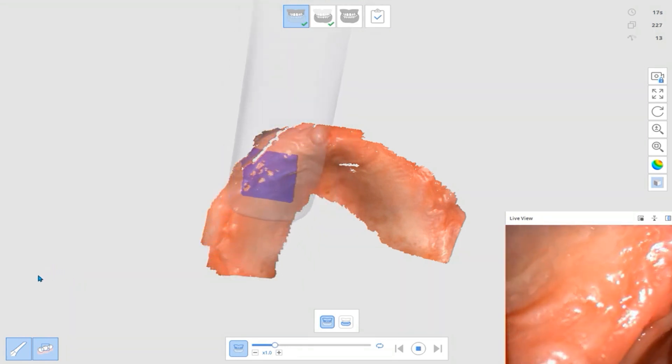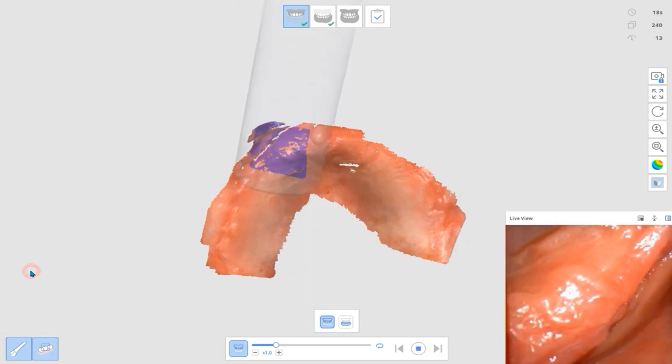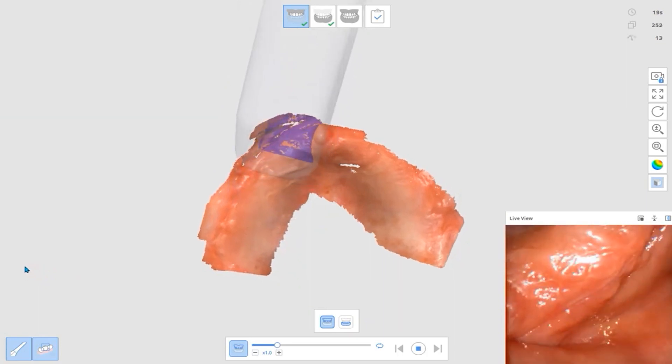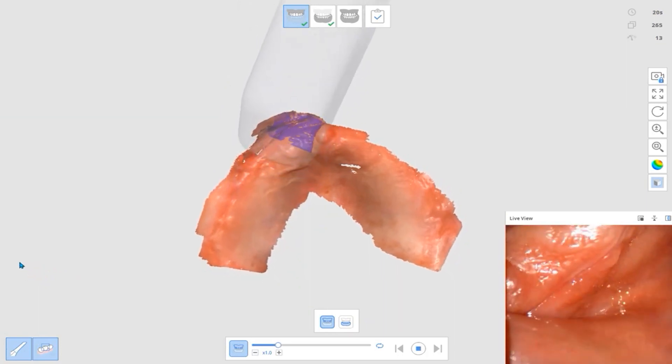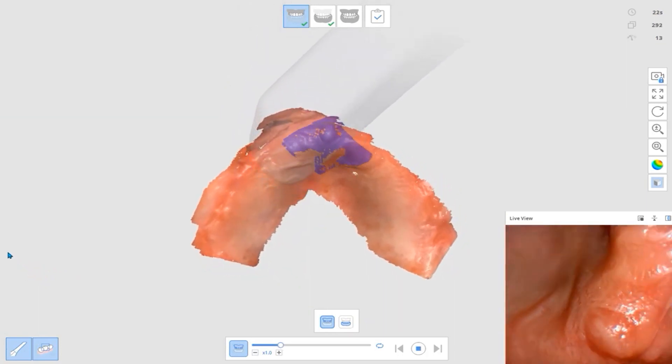Then, move on to the buccal side and make sure to include the vestibule and the frenum.